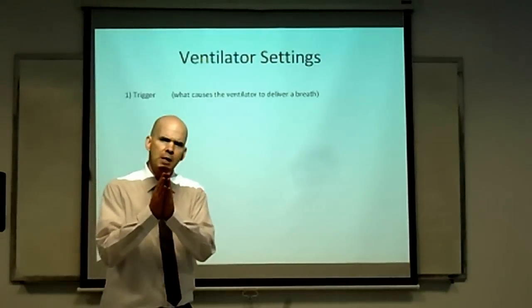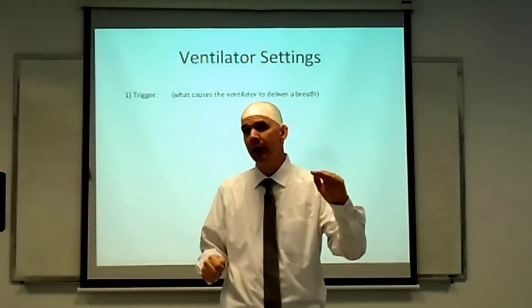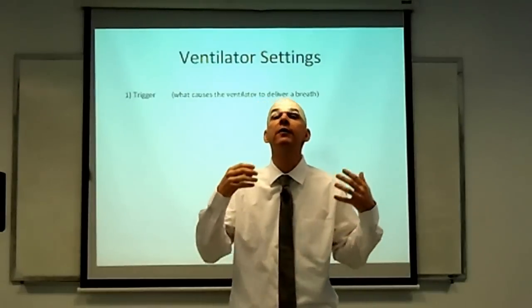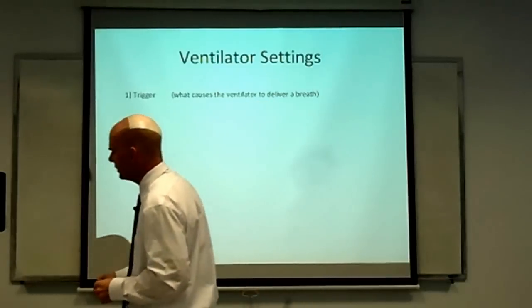So our key in dealing with trigger is to set the sensitivity high enough that the patient doesn't have to work too hard to breathe, yet low enough that we don't have the machine firing inappropriately. Let's look at the next setting.